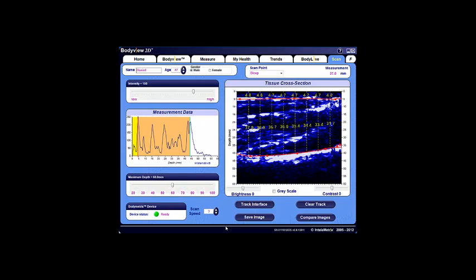The BodyMetrix system allows you to control the depth of the scans, and the default setting is set at 60 millimeters. Depending on how muscular an individual is, or conversely, how sedentary or obese they are, it may be necessary to adjust the depth accordingly if you're not able to see where the muscle meets the bone, or the muscle-bone interface. You can always adjust the depth and immediately repeat the scan to capture and display the tissue. This is especially helpful with obese individuals carrying substantial fat in targeted areas, or for bodybuilders with extremely muscular thighs or biceps. The 60 millimeter default depth setting is generally fine for relatively fit individuals.